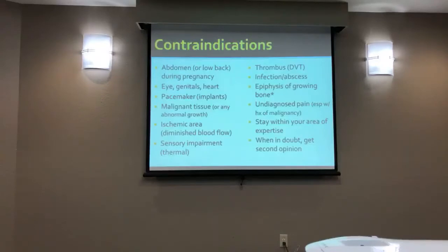The point stimulation. My curiosity would be, would 10 seconds, 20 seconds of point stimulation offer a similar benefit of spasm reduction, trigger point reduction, combined with the stretch, to improve range of motion? Could you possibly have the same outcome in a more efficient manner? Sadly, the question I might get is, how would I get paid for a 10-second treatment? But if I did 8 minutes of ultrasound, I could get paid. I'm like, well, that's where our billing aspect needs to change and make us as efficient and effective as possible, unrelated to the reimbursement. If it gets them better, faster, and we get better outcomes and our population demands it, we're going to use what works rather than what I can get paid for.